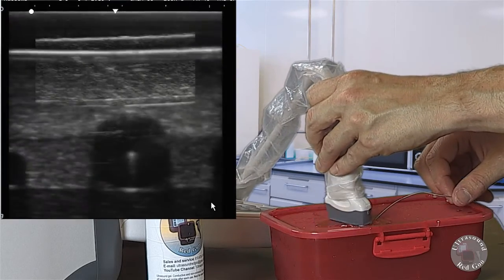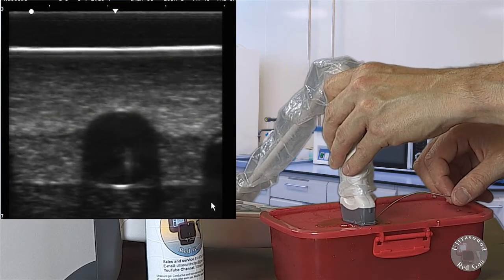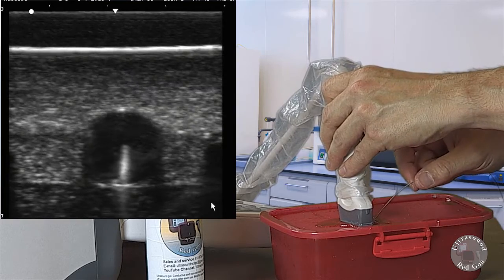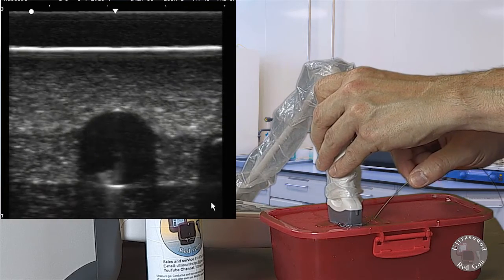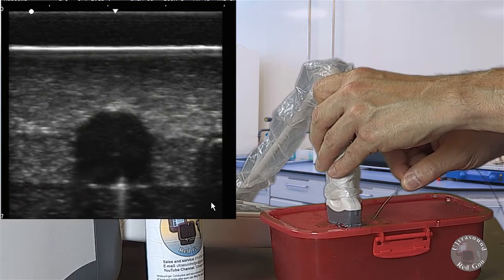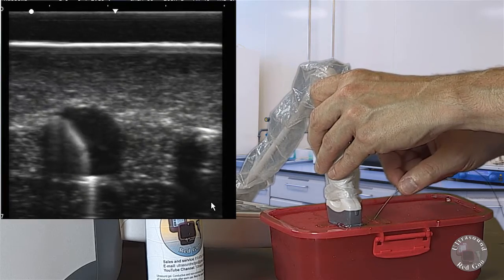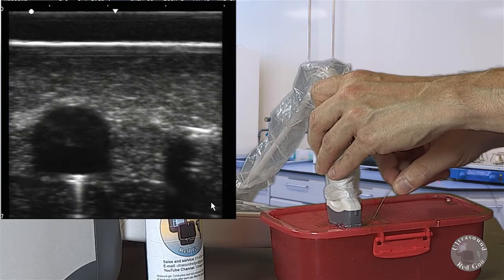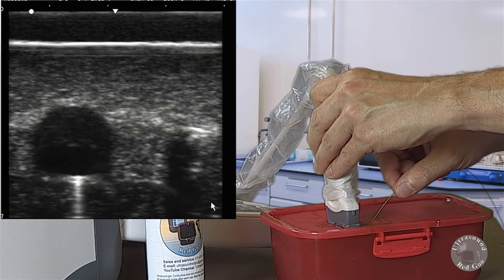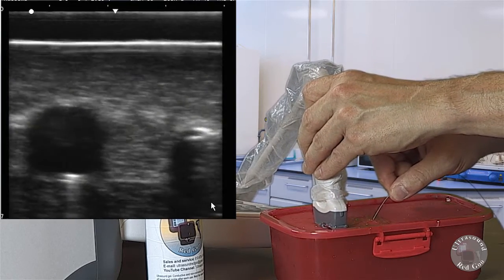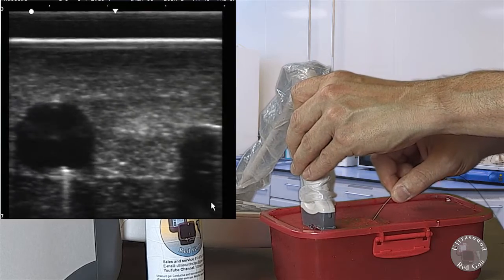Now I'm also going to take a look out of plane. When I do out of plane, I'm going to go as distal as I can. When I look right there I've got a good shape. What I did is I actually took an extra long J-wire and bent it at the tip so you could see that J there. That's actually bent up. And I'm going to go all the way down to the end of this target right there and I see the tip.